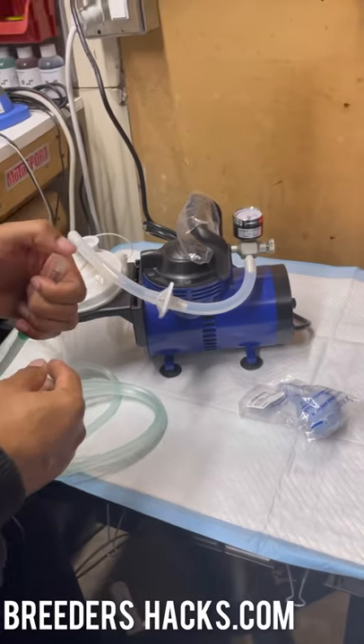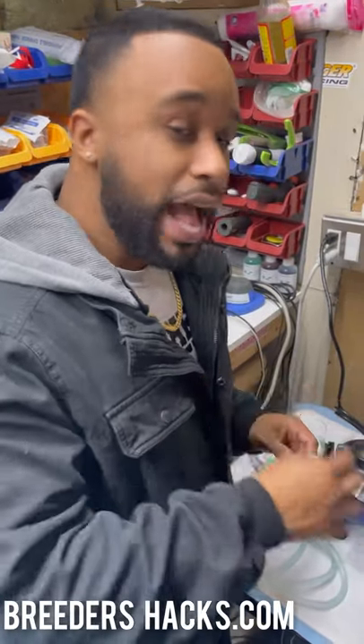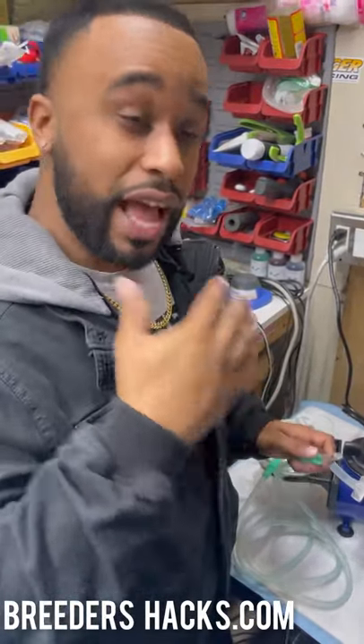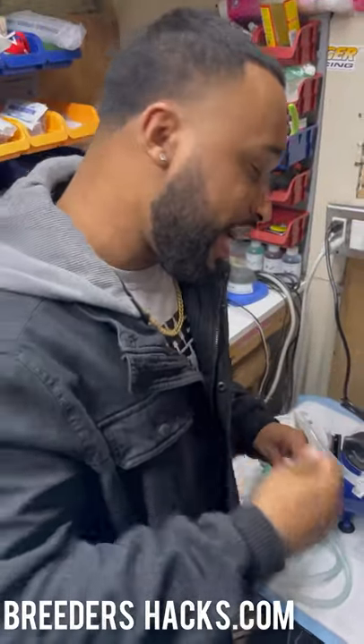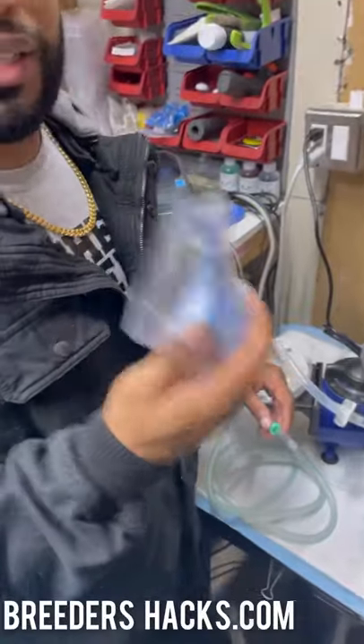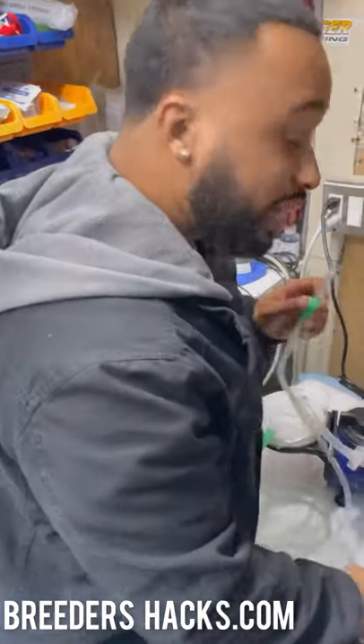I've used this to save plenty of puppies. If you catch milk in the nostrils early enough and use something like this, it will make sure everything is suctioned out — not just a little bit like the handheld aspirator. This machine really ensures it gets everything out.